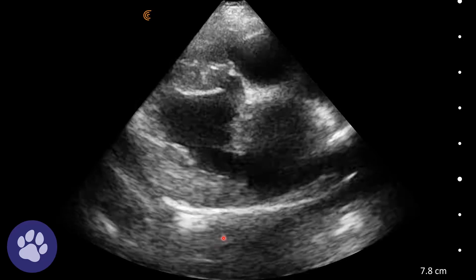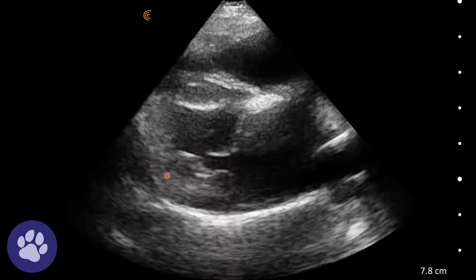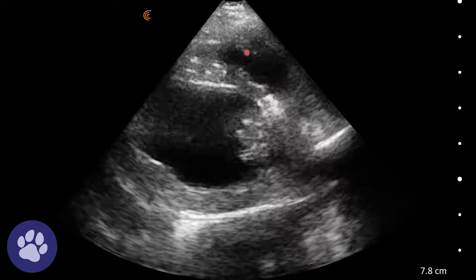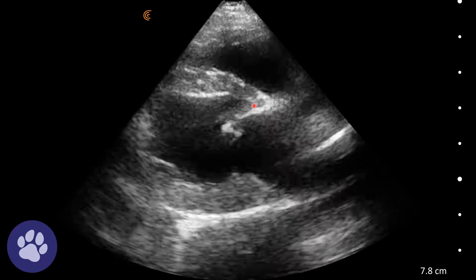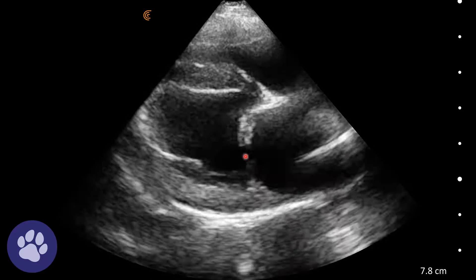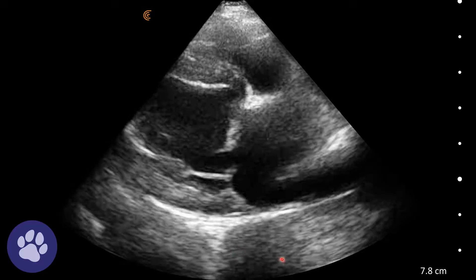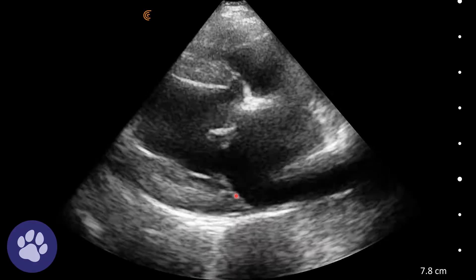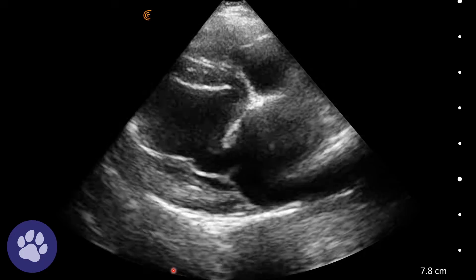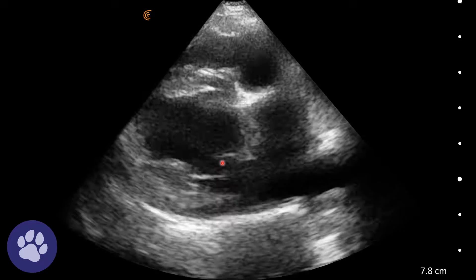Here we have the long axis view of the heart. We can see the left ventricle here, the right ventricle here, tricuspid valves here, right atrium, left atrium and mitral valves here. We can see the mitral valves appear a bit thickened. This is a better right parasternal long axis view where we can see the mitral valves opening and closing and that they're a bit thickened.